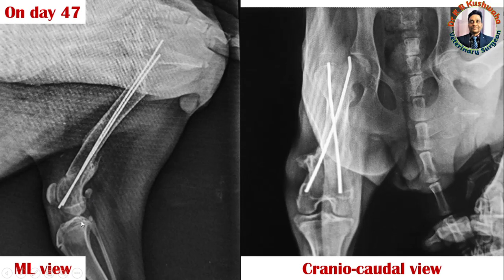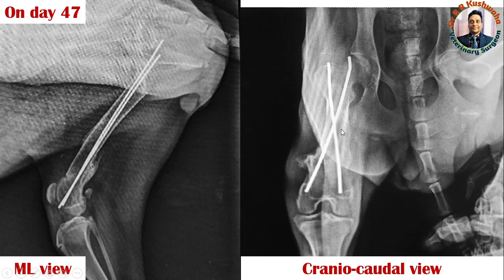Looking at the tibia, there is no problem there. In the craniocaudal view on day 47, there is no fracture line visible, and the extra callus is seen towards the lateral side. Combining both views, we could say the extra callus formation is at the caudal and lateral side. On the basis of these mediolateral and craniocaudal views, along with physical examination and the condition of the animal, we decided to go ahead with removal of both K-wires from the trochanteric fossa.